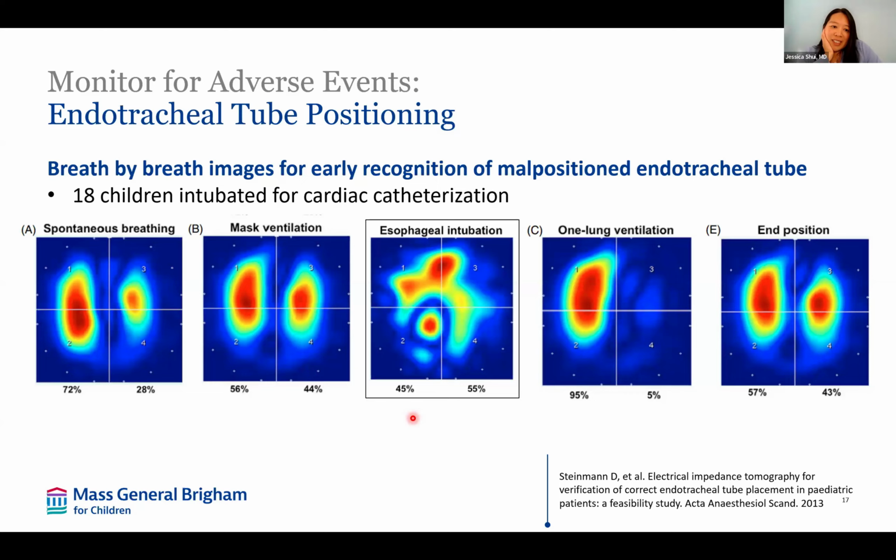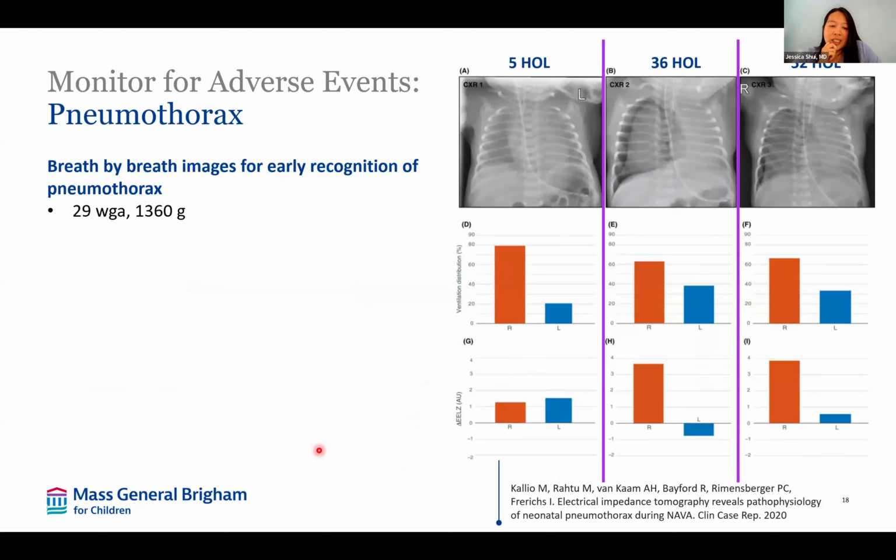And I know my nursing and respiratory therapist colleagues really feel that frustration every time you have to retape your endotracheal tube, get an X-ray, find out it's too deep, and you retape, and it's like, oh, now it's too shallow. But if you could have this feedback at the bedside, I could see a lot of potential for causing less stress on the infant, with all the extra stimulation of trying to perfect your endotracheal tube positioning.